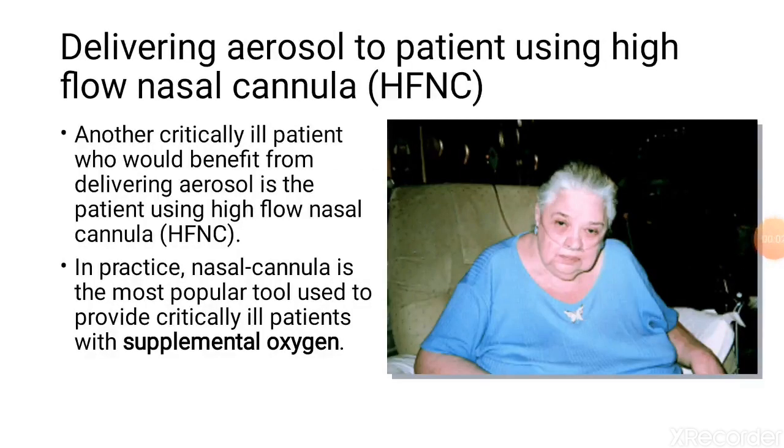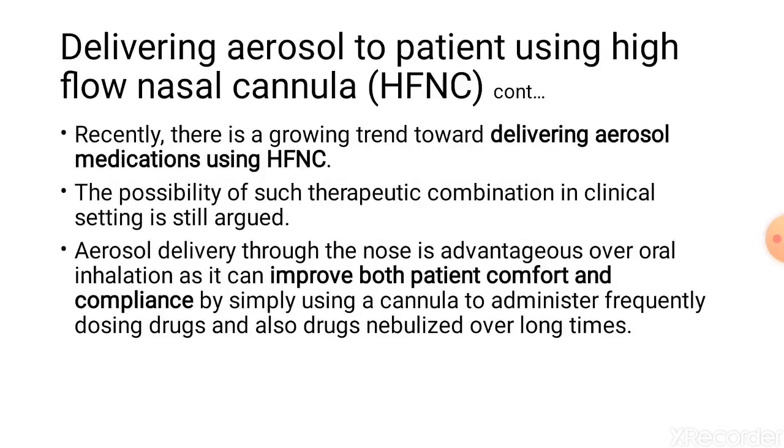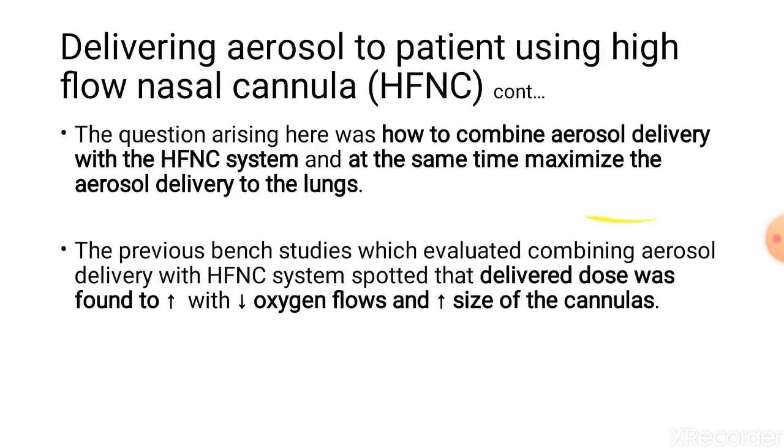Another patient that might benefit from aerosol delivery is the high flow nasal cannula patient. This is actually a new technology to merge the aerosol delivery method with the high flow nasal cannula. It's simply better for the patient, more compliant, and more comfortable. The delivery using this is based on two things: the aerosol delivery position within the setting, and the oxygen flow. The lower the oxygen flow, the better the delivery. The higher the nasal cannula size, the better the delivery.